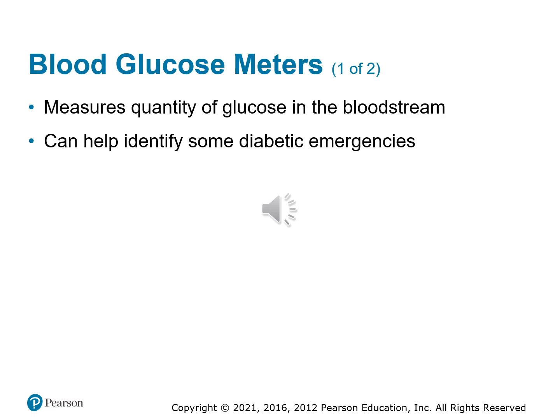Next device here we'll talk about is the blood glucose monitor. Remember, glucose is the fuel to the body, and so what this is going to do is measure the amount of glucose in the bloodstream. Commonly, we use it in diabetic emergencies, but honestly, we check blood glucoses on just about every patient, because it's one of those things that you might find something that could indicate some sort of medical conditions, and it's not an obscenely painful process to check it on your patient. So it is very commonly performed on patients.